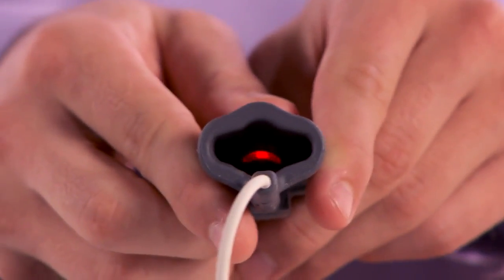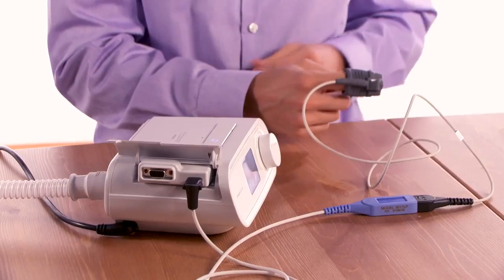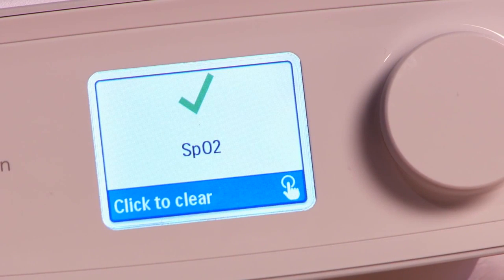A red light will appear in the sensor. Attach the oximetry sensor to your finger. You are now ready to start a therapy session. Fit your mask as you normally do and turn on the therapy device. The therapy device screen will display an oximetry good connection icon after the device detects three seconds of a good connection.